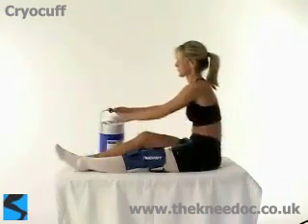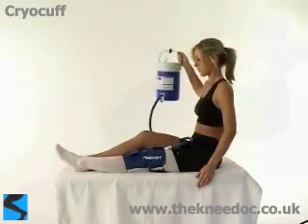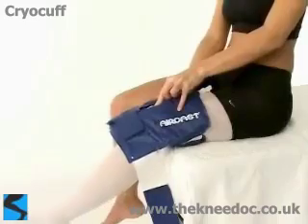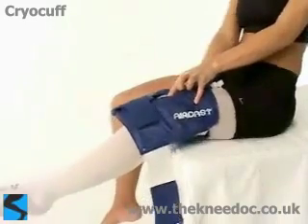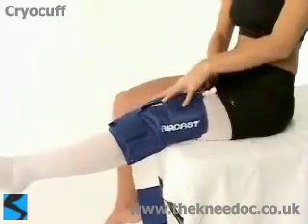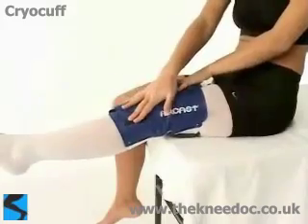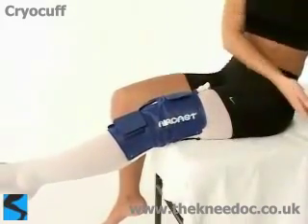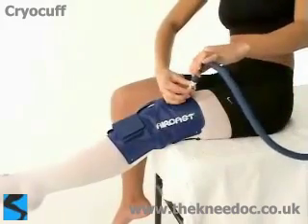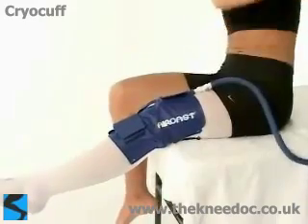It is easier to put the Cryocuff on with the knee straight, and the first thing to do is find the top of your kneecap. The hole in the sleeve at the front of the Cryocuff goes around the kneecap. The nozzle which connects to the canister should be facing upwards towards your hip and your face, not towards the foot and ankle. The top of the hole at the front of the knee sleeve goes at the top of the kneecap.